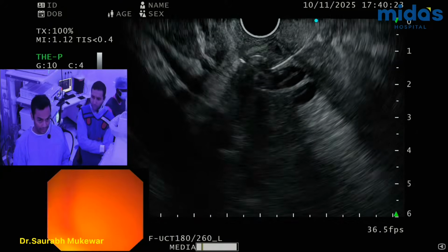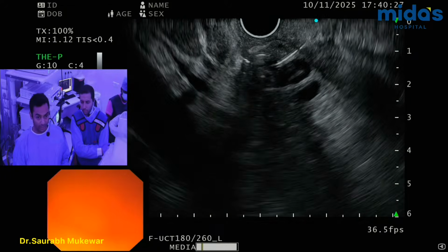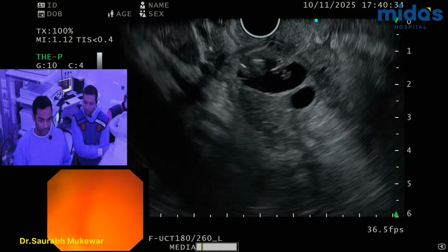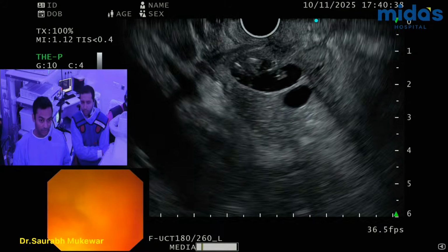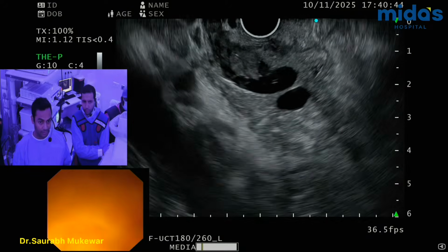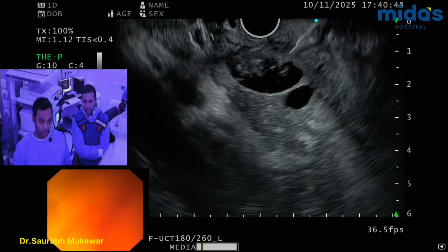Then we had, if you just can't reach the ampulla and you don't want to do choledochogastro and you can't find an axis, then you do this one. Or it's a hilar block, right? If it's a hilar block, proximal blocks, then you do hepaticogastros. ERCP not possible, infiltrated ampulla, duodenum, those are the ones you do, when I do more of.